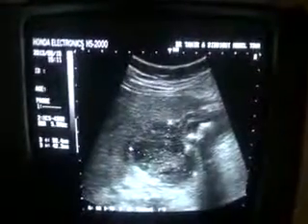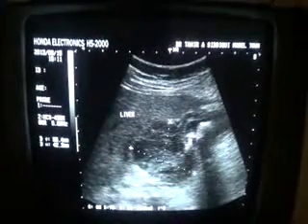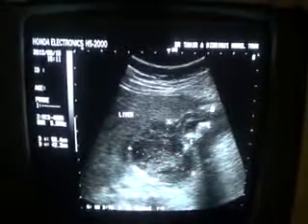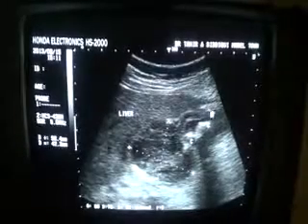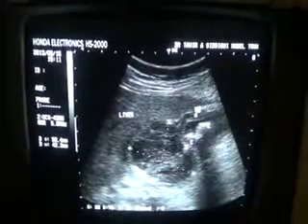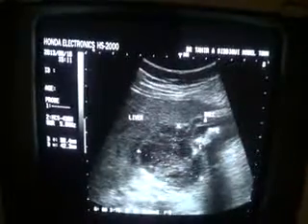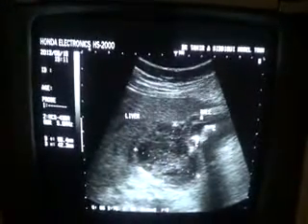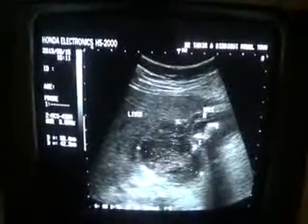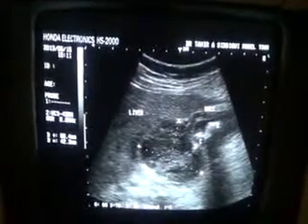in a patient with cholelithiasis, thick edematous GB wall, and small amount of bile that you can see within this almost contracted gallbladder, a post-meal contracted gallbladder.